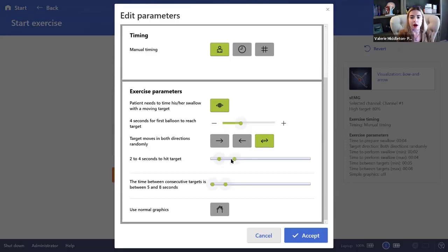And you can see that. Okay. Some of the other options you have, they're a little bit different here. Of course, you have your rest period. This can also be a range of time. It defaults to 5 to 8 seconds. You can make that more if you felt like they needed more of it, up to 10 seconds, kind of like the work rest cycle, you could do that here as well. You could also have it overlap, so it's not a change each time, and it's just maybe 5 seconds every time for that rest period. Same way as we just looked at for the work time.